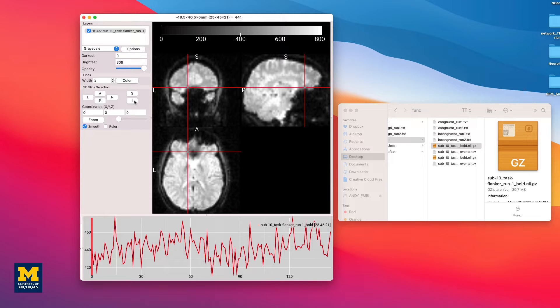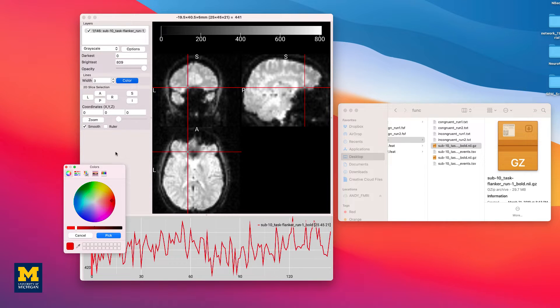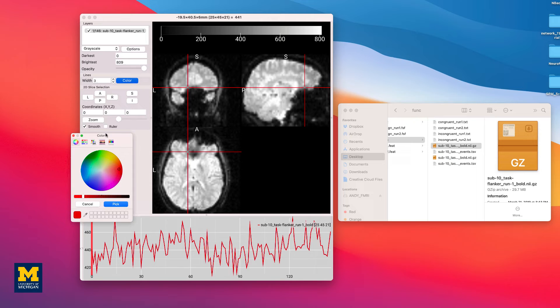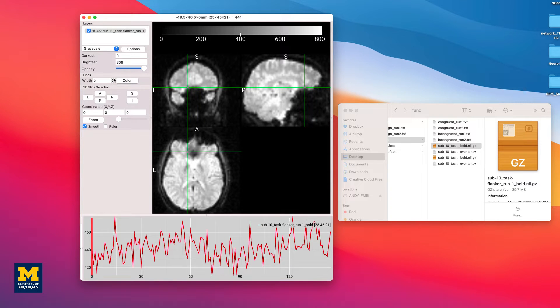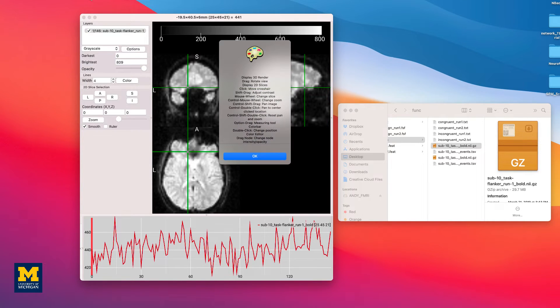If you prefer a different color for the crosshair, click the color button and select any color that you like. The width of the crosshairs can also be modified by increasing or decreasing the value in the width field by clicking on the up or down arrows. A full list of mouse clicks and button presses can be found by clicking on Help and then Mouse Gestures.